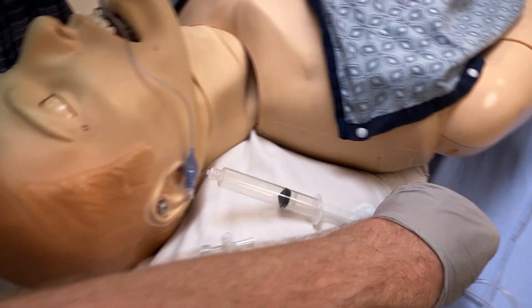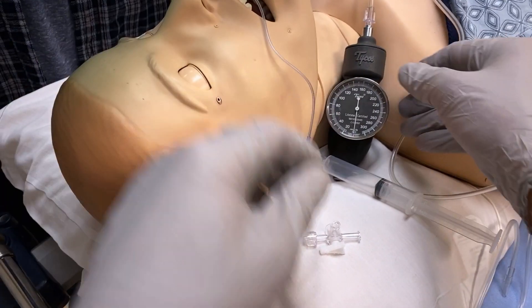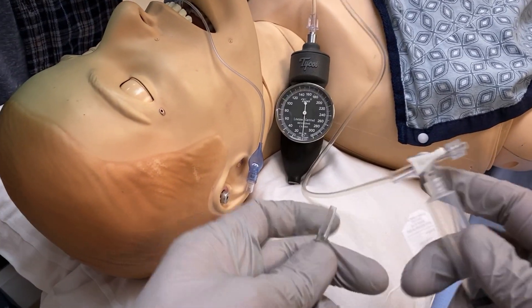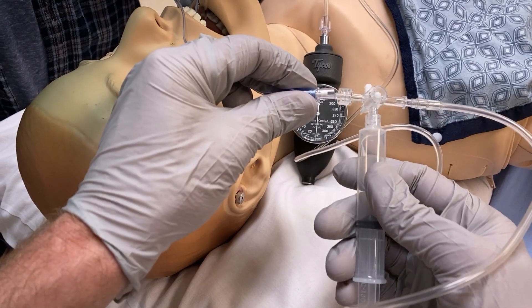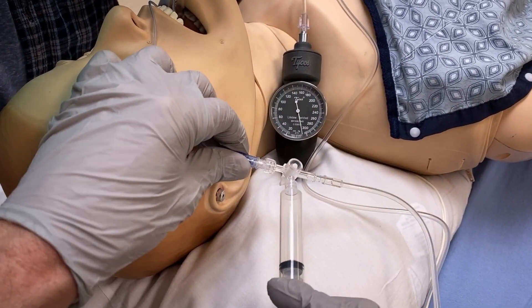Connect the IV extension tubing to the blood pressure gauge. Then connect the three-way stopcock to the tubing and syringe with all the ports open. Now you're ready to attach your setup to the pilot balloon and inflate. When you inflate the cuff, you can see the pressure on the gauge.